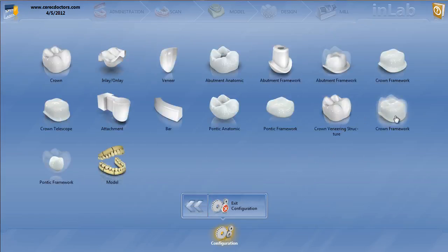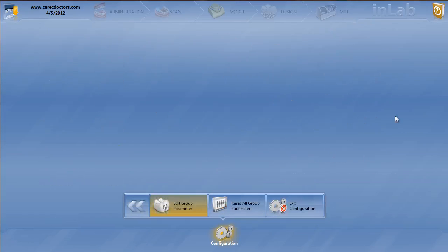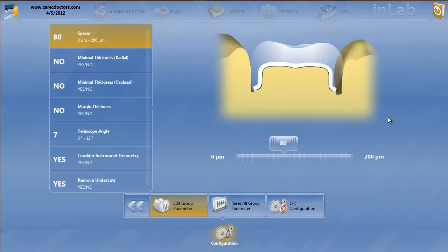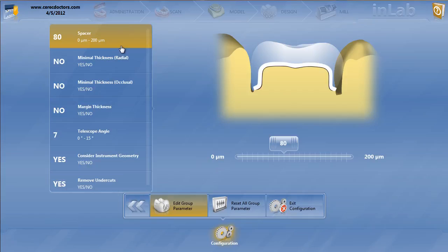Now, let's go to crown framework. These will be the frameworks underneath the crown, so underneath the abutment teeth. Spacer, generally I'm going to keep it at 80, because a lot of times these are going to be zirconia, especially if I'm doing CAD-ON or VITA rapid layer, and I cement those. So when you cement a restoration, you want the spacer to be a little bit lower.